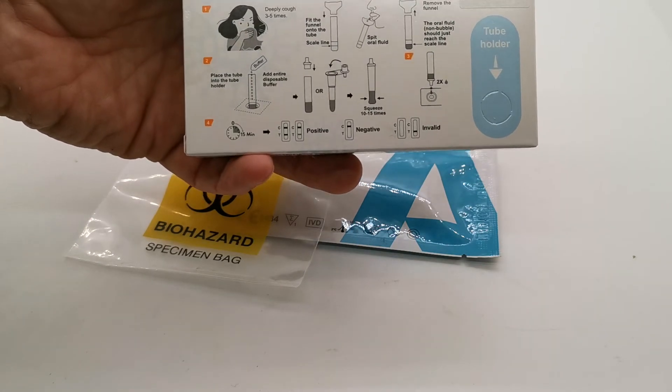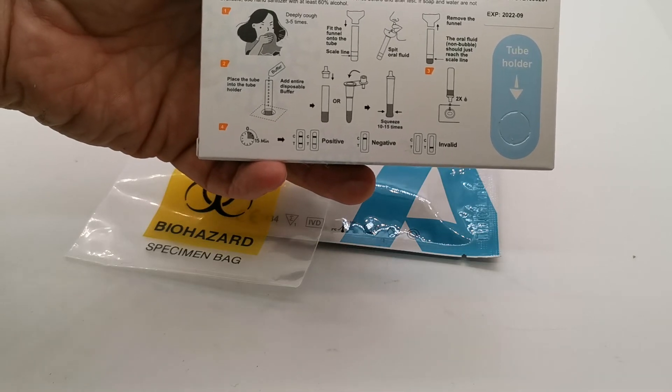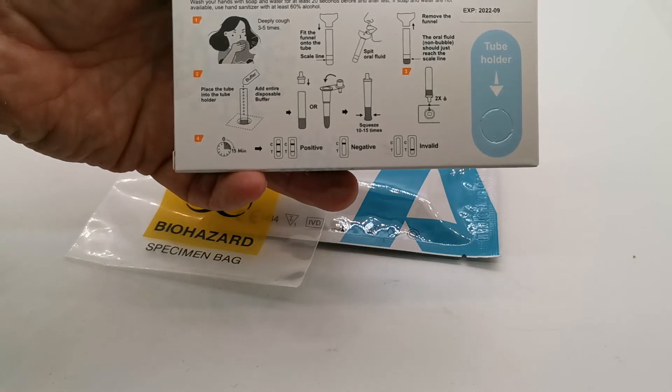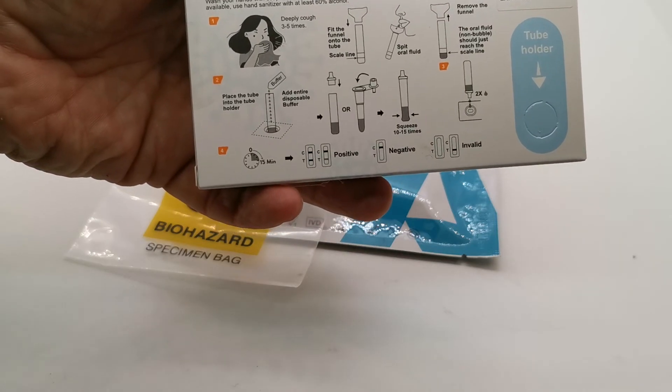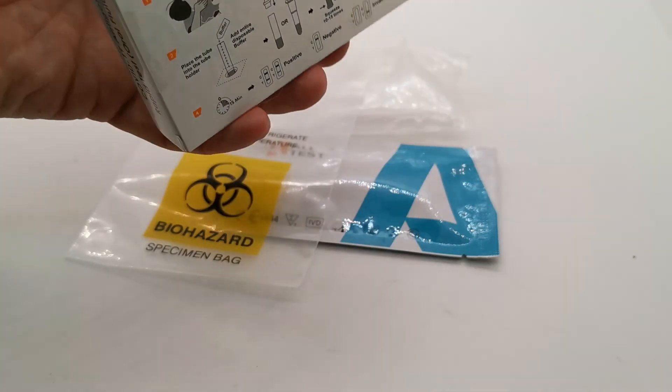The packaging also gives you guidance on interpreting a positive and a negative result. A negative result is indicated by a clear control line with the absence of any test line at read time. A positive result is indicated by both a thick and thin — even a very faint — test line in the presence of a control line.